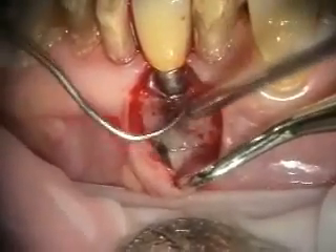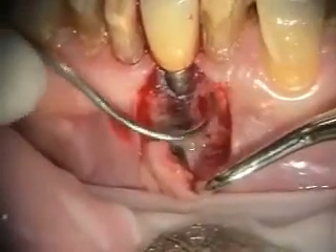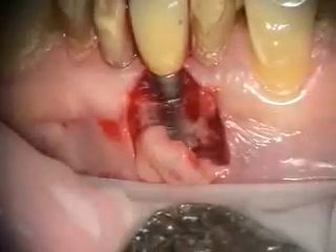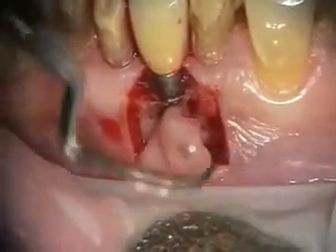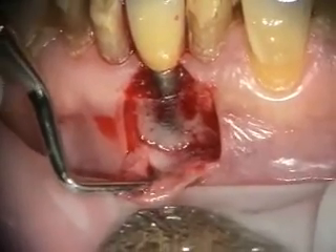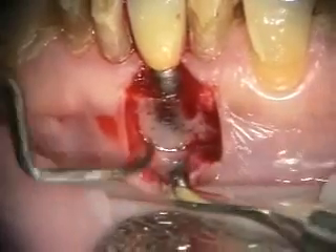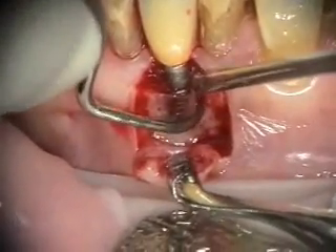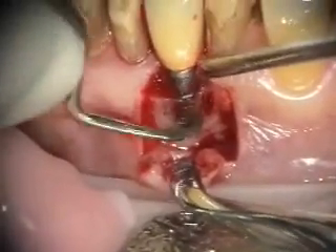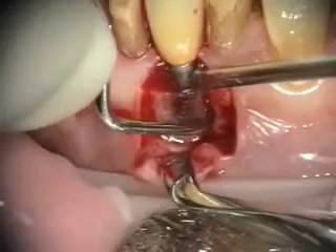I'm not sure if that caused this or not. Make sure you get that out of there. It's funny because it's not near the implant — I mean, it's near it, but it's not connected to the implant.